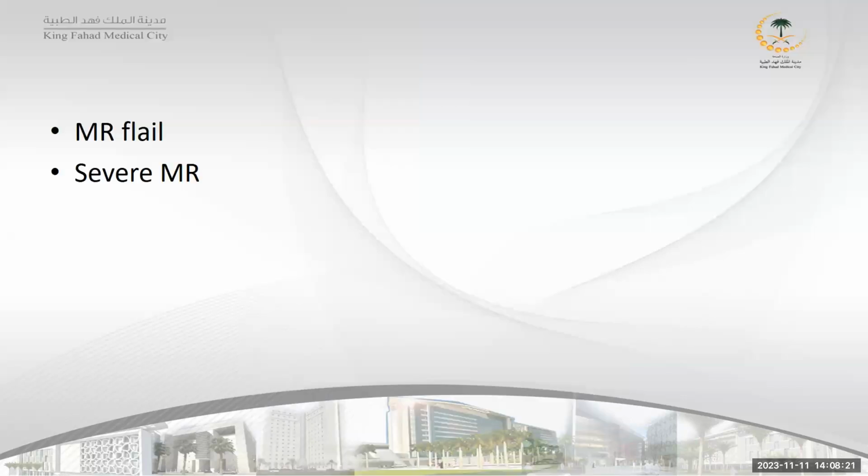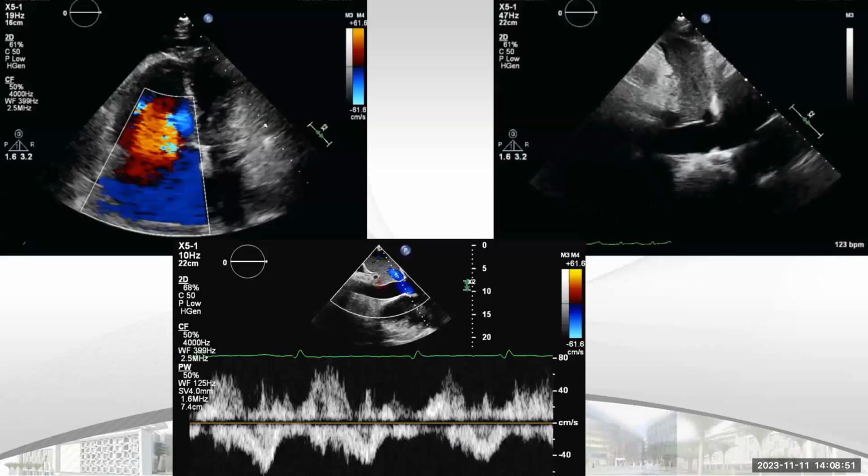We have two phenomena very good to know in significant MR. One is Coanda, as you said, and the other is momentum. Once you have severe hypertension, the MR jet will be overestimated. Once you have low blood pressure, the MR jet will be underestimated. This applies to functional mitral regurgitation, not to primary MR like in this case. Okay, next.